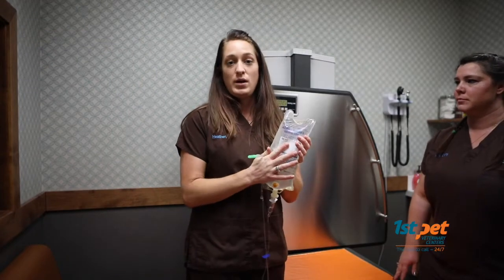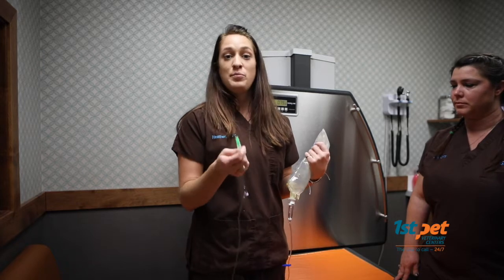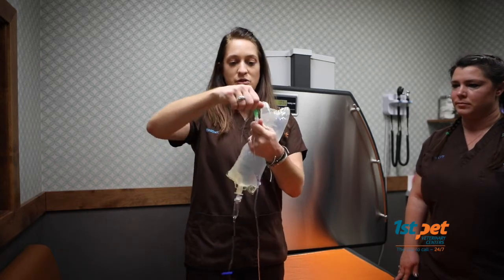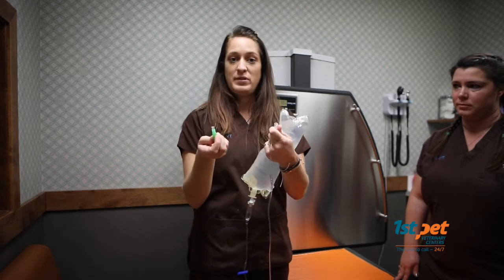Now that you're due for another treatment of fluid therapy and you still have your old needle on, it's important to change out your needle every single time. When you do that, you'll just be twisting it off of the end of your administration line, and it should come off very simply for you.